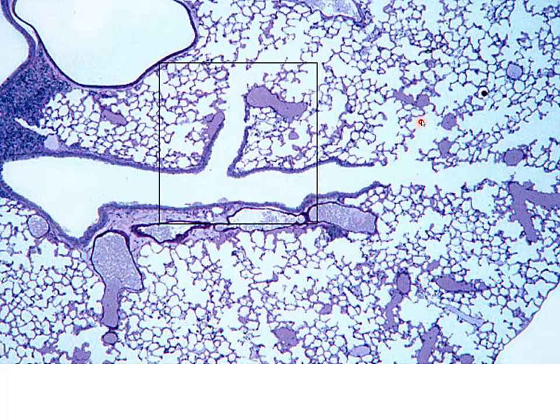Here we have an alveolar duct. Here we have another terminal bronchiole, possibly a short stretch of respiratory before we move into an alveolar duct. Now, from these points forward, we're just saying a bronchiole because these aren't extremely close to the point that respiration is actually going to begin.